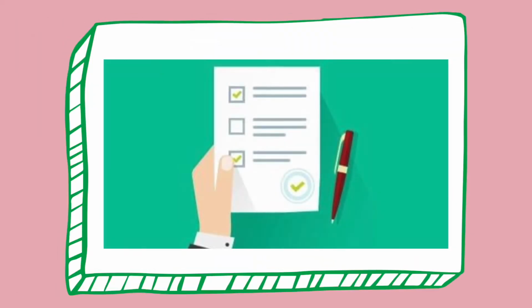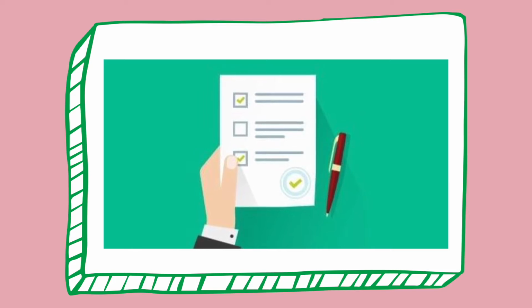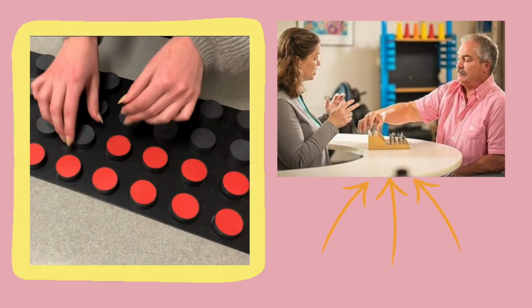This test may also be used in vocational evaluation or employment screenings to test subjects' aptitude for tasks involving manual dexterity. Furthermore, the Minnesota Manual Dexterity Test may be administered on adults in rehabilitation and with the elderly population.